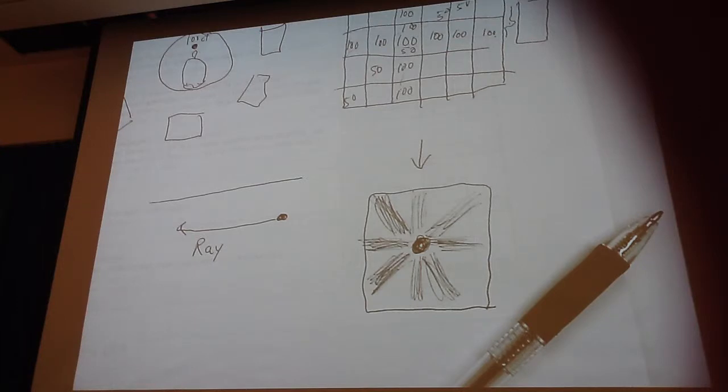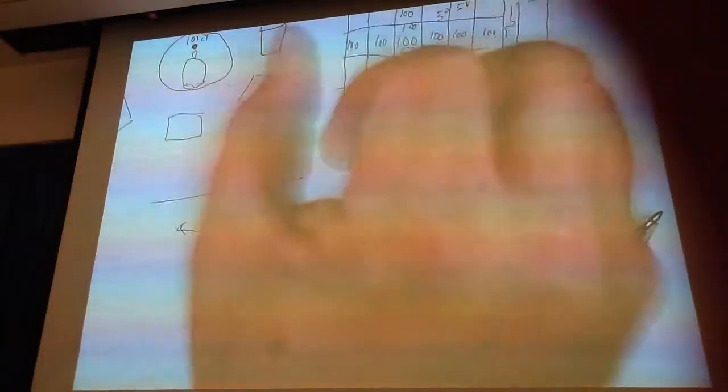We're not monitoring the heart for anything. What we're basically trying to do is we want the heart images to be taken at certain phases of the heart cycle. Okay? Because if I have my hand here and it's going like this, what's the problem?